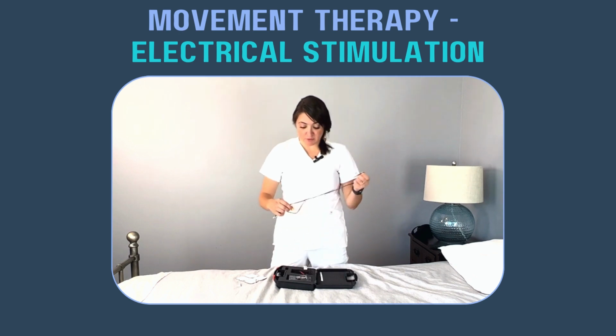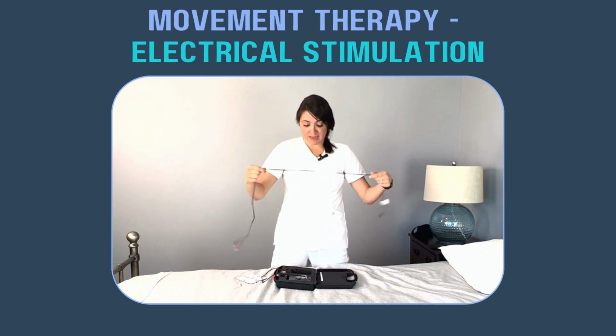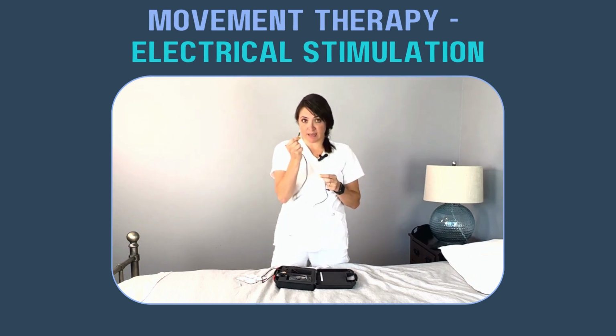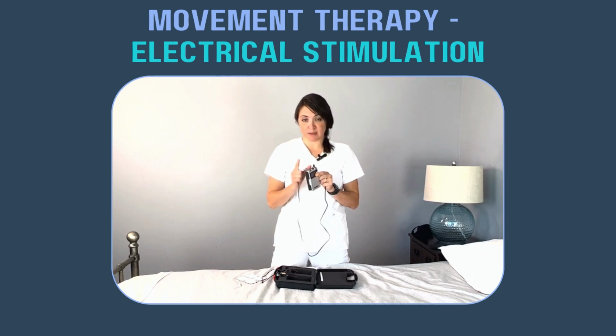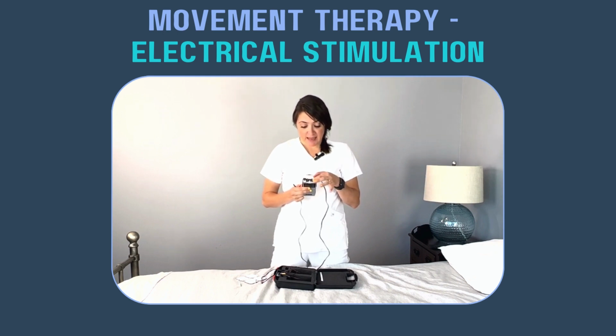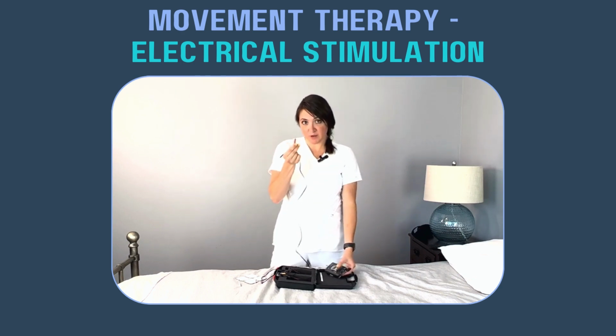Another thing is, when you do get it, it's going to come with these wires. These wires have a black and a red end, and then this prong. This prong is going to simply plug into the hole. I like to use one at a time for simplicity, but if you wanted to, you could get more complex and use 2 cords and 2 electrodes. But for all the videos we show you, we're going to go super simple with it. So you plug the prong in, and then this little dial helps to increase or decrease intensity. And again, I didn't mess with anything. I literally opened it up, plugged the prong in, and then I have these wires.